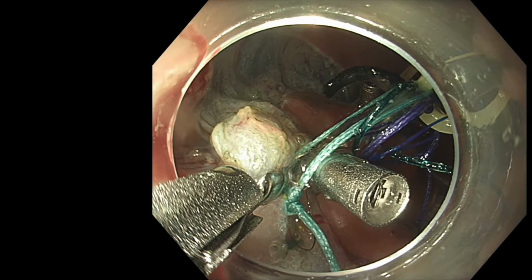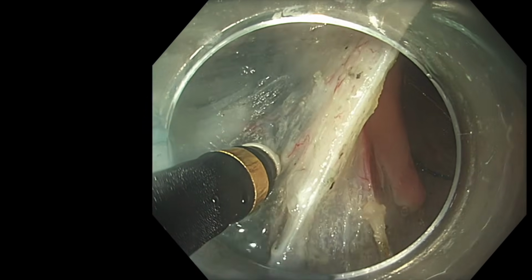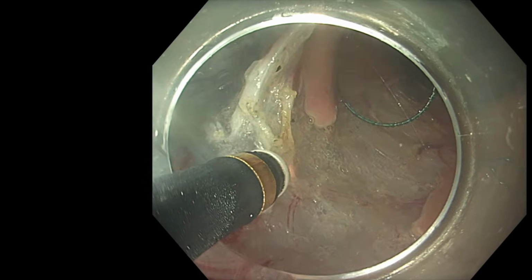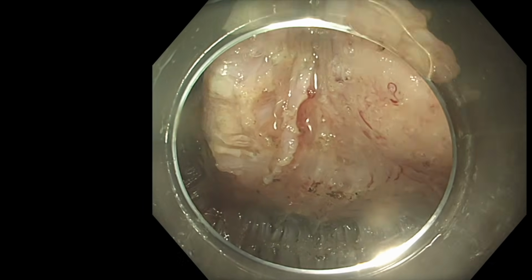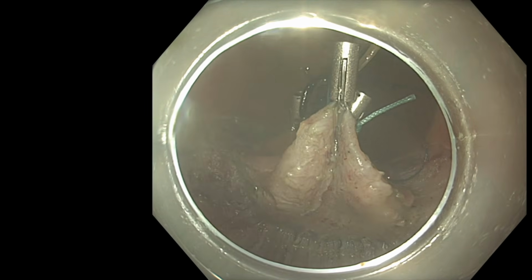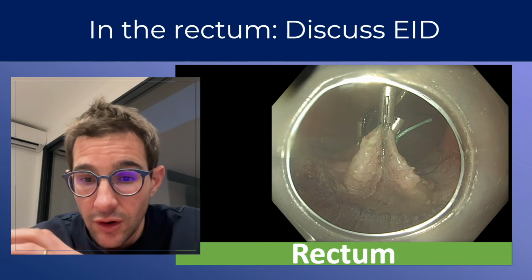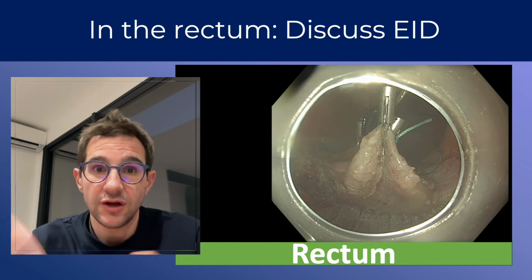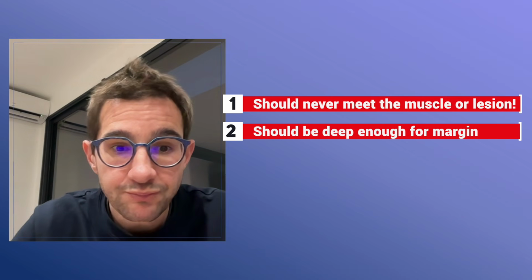Sometimes for patients with a lot of comorbidities or when surgery is not an option, dissecting in the intermuscular space could allow you to be R0 without creating inflammation around the rectum for a further examination, but making it able to cut the intermuscular layer and get an R0 resection even if there is a deep submucosal invasion.